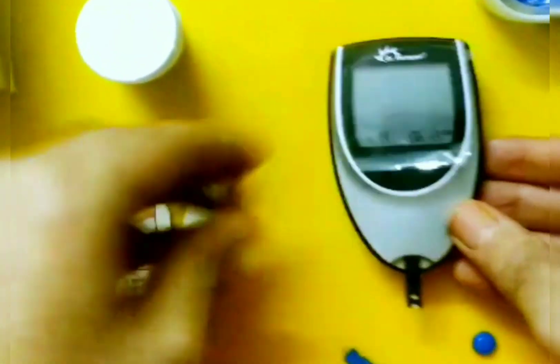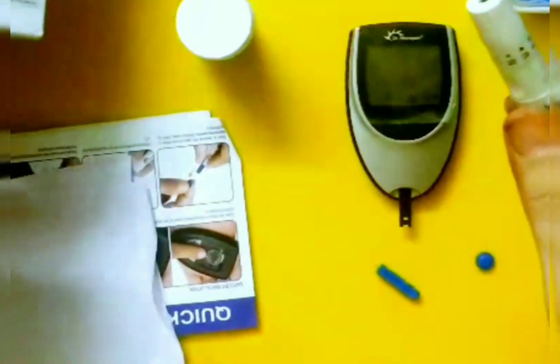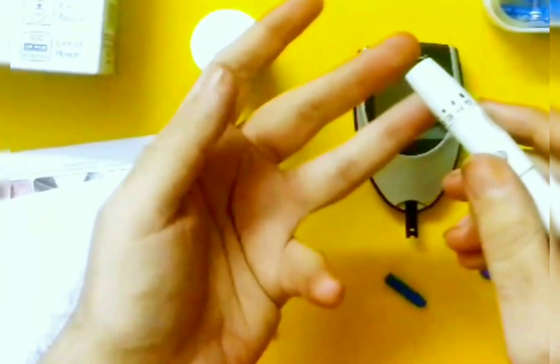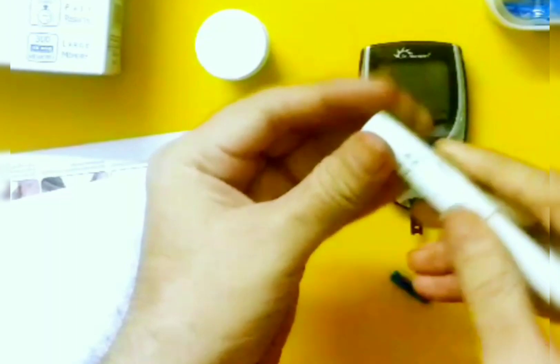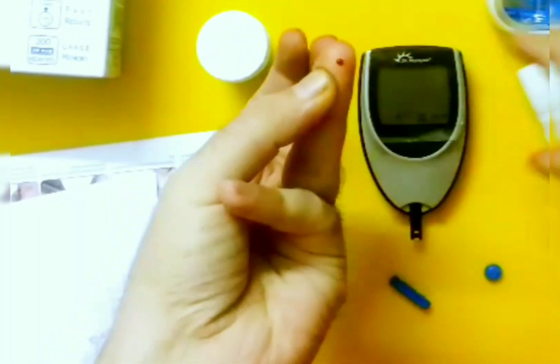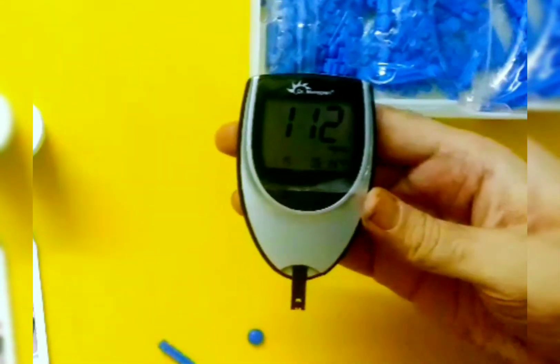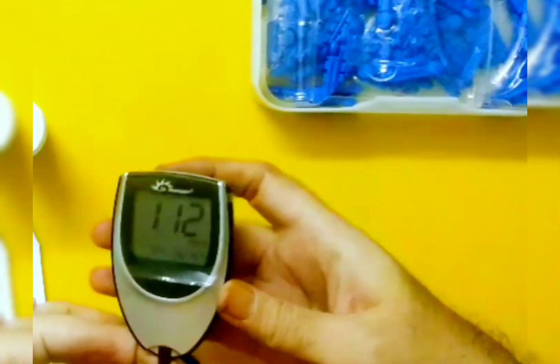The lancing device is ready for testing. I'll now prick myself to take out a small quantity of blood and then do the testing. Just put it on any of your fingers and press on this part. I'll put the setting on four, which is best for me. Just press this button — you'll see the blood come out. Put the strip on the blood and it will count till five. The sugar level is 112 right now. The results are ready. You can dispose of the lancet and the test strip.